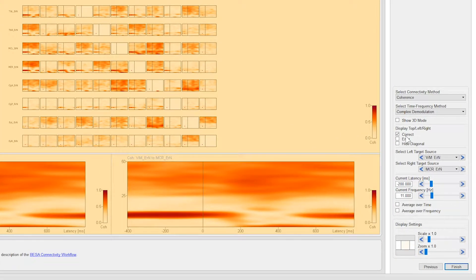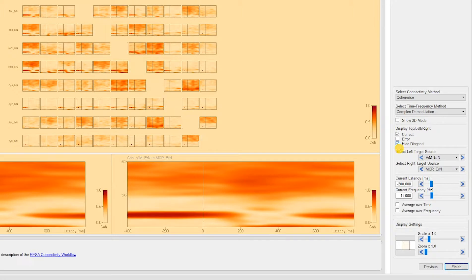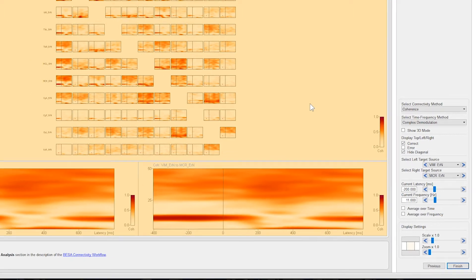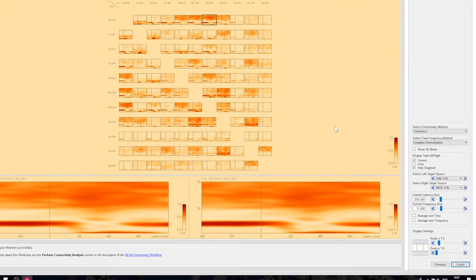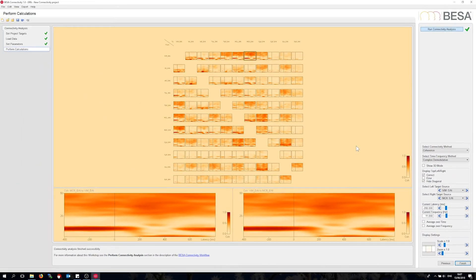This checkbox shows me that we're looking at the correct answers here. First of all, let me hide the diagonal, which is just the self-spectrum. One issue that is typical for coherence is that for source montages, there may be a common noise modeling in different sources, which shows as a large coherence value between neighboring sources.